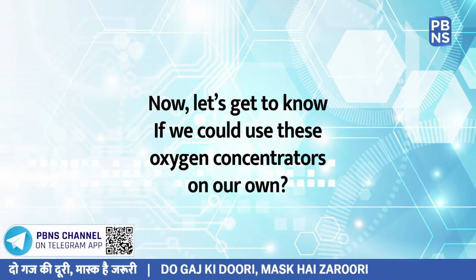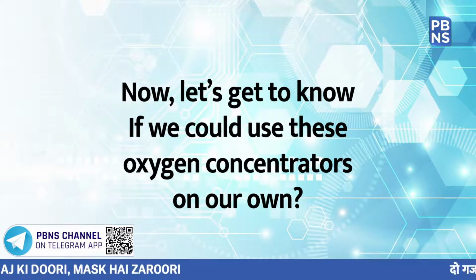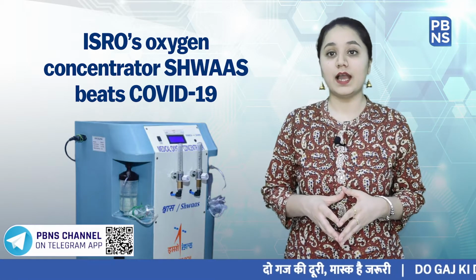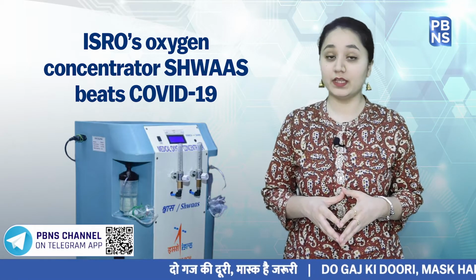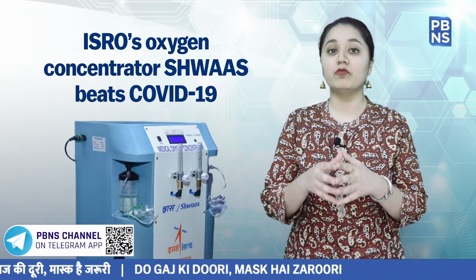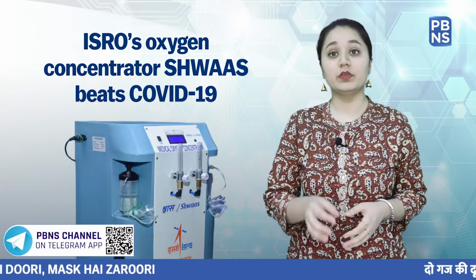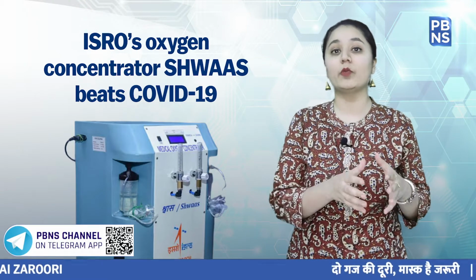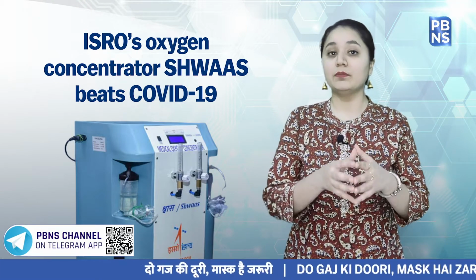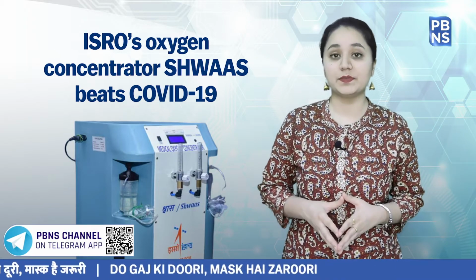Now, let's get to know if we could use these oxygen concentrators on our own. Dr. Chaitanya H. Balakrishnan, COVID co-coordinator at St. John's Medical College Hospital, informed that using oxygen concentrators without medical guidance can be very harmful. He also apprised that patients with moderate pneumonia induced by COVID-19 with oxygen saturation less than 94 can benefit from supplemental oxygen, but only till they get hospital admission.